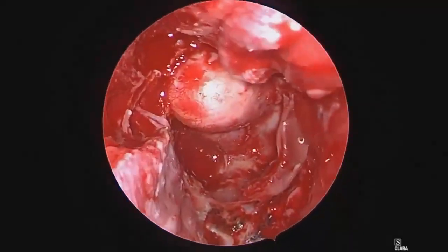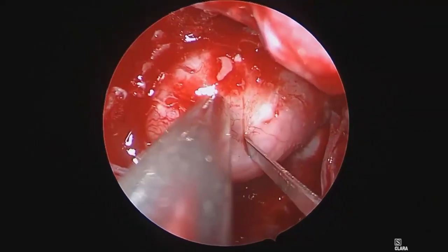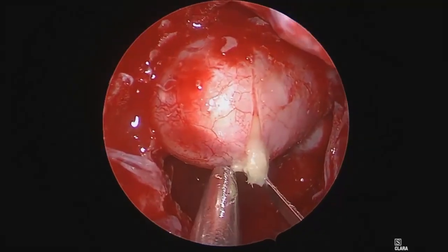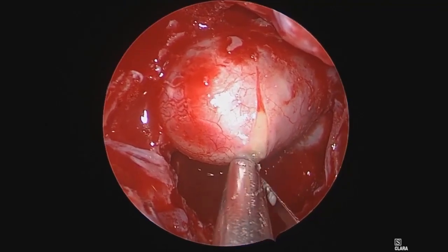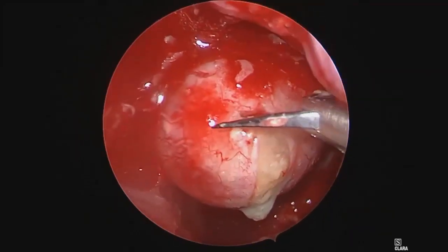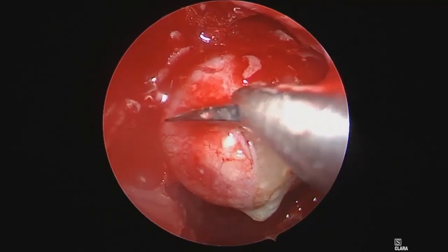This exposes the surface of the dermoid, and a dural incision is made with a feather blade. Immediately upon making an incision through the dura, the contents of the dermoid cyst are quickly seen and aspirated. These are highly suggestive of compact keratin, which is very unique and common to these lesions.